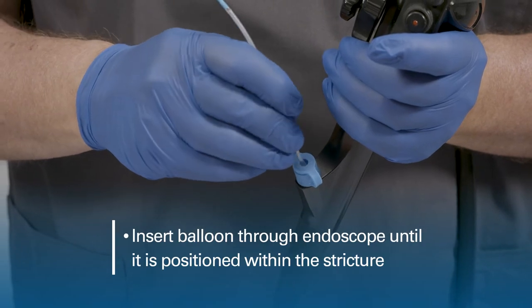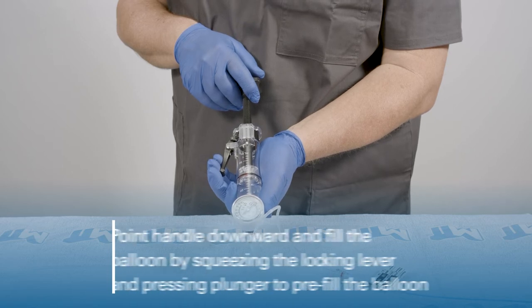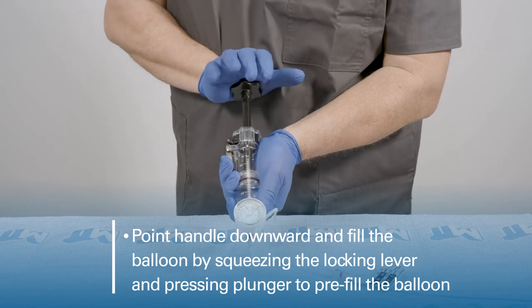Insert the balloon through the endoscope until it is positioned within the stricture. Point the handle downward and fill the balloon by squeezing the locking lever and pressing the plunger to pre-fill the balloon.